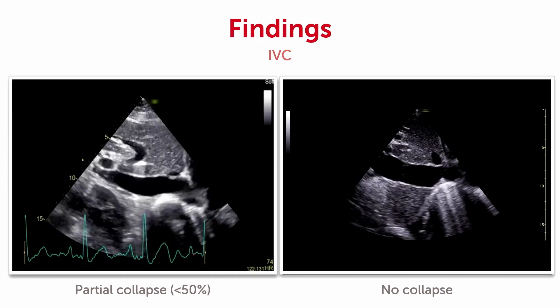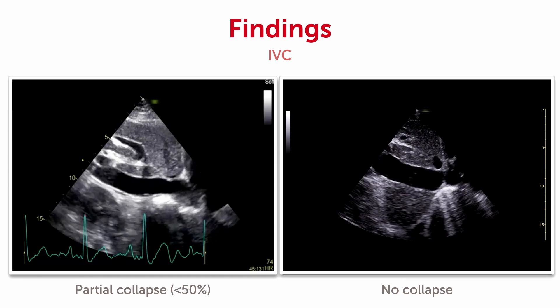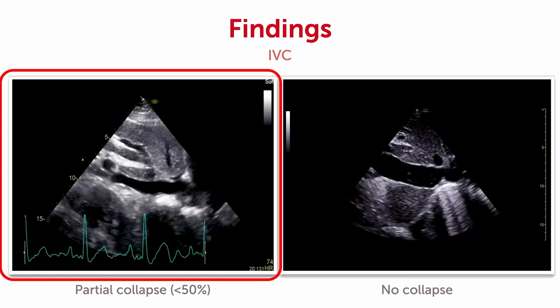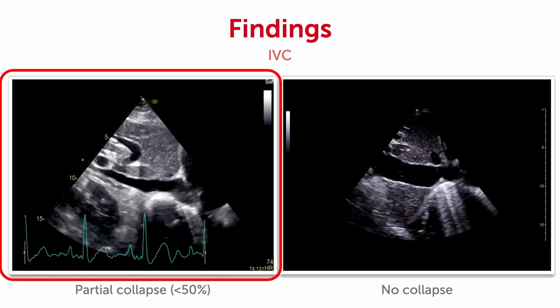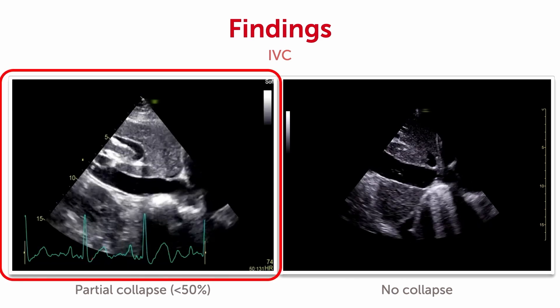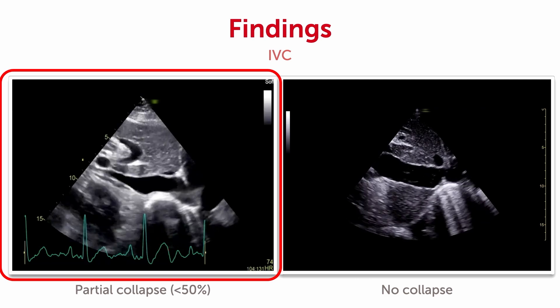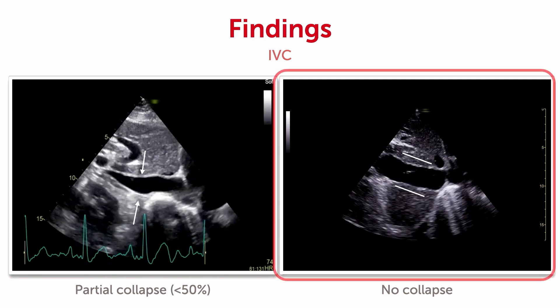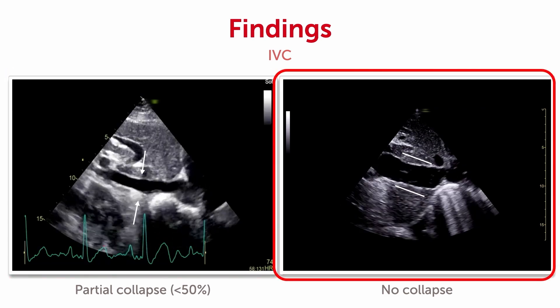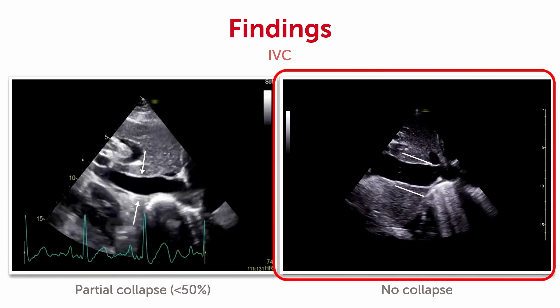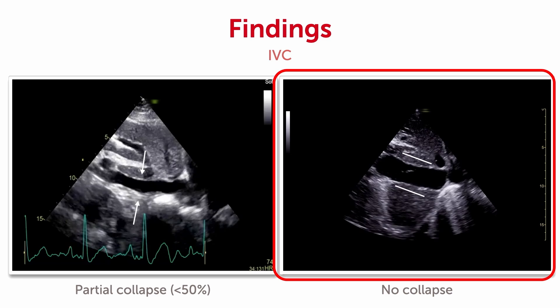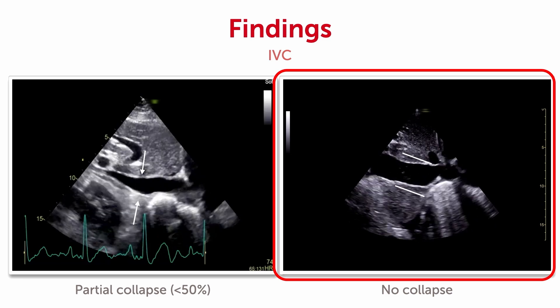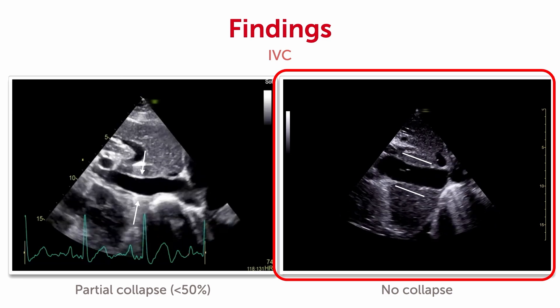You can now see two examples. On the left hand side, a normal IVC which decreases in size during inspiration. On the right hand side, we see an IVC that does not decrease in size and which is enlarged. In the right situation you would have increased right atrial pressures.